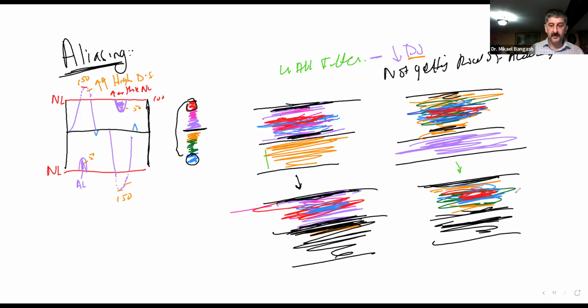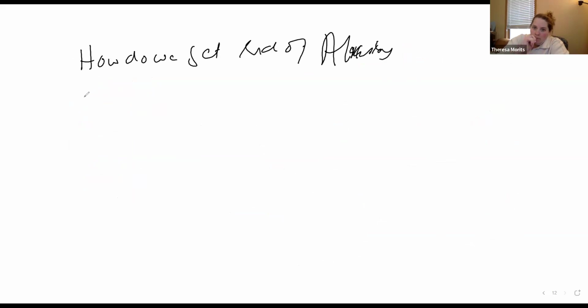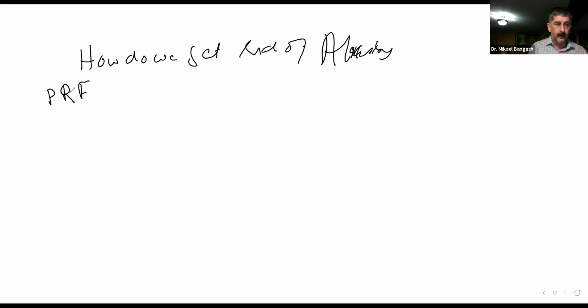So what was our primary step to get rid of aliasing? Does that increase the PRF? Yes, on the system, we increase the PRF.